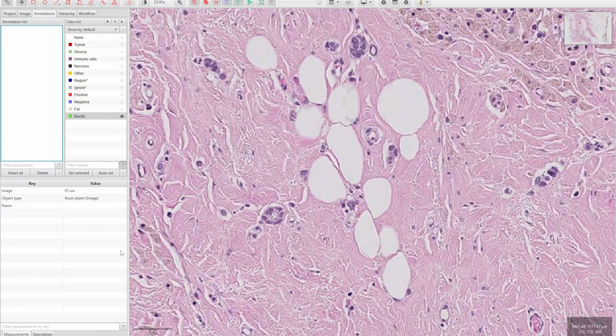If you did that for each annotation, it will be tedious. So if we need now to start annotating a set of nuclei, and we need the program to auto-select and auto-set the nuclei category, then simply click on nuclei and press on auto-set. So once you select the rectangle and start the annotation, rectangle again, start annotating this region, you will have now two annotations reflecting the nuclei.